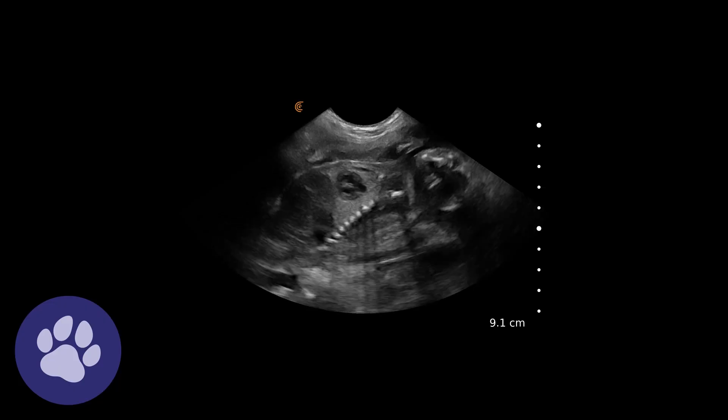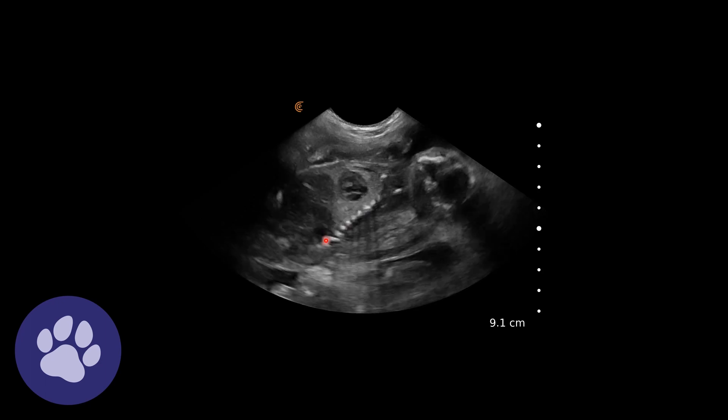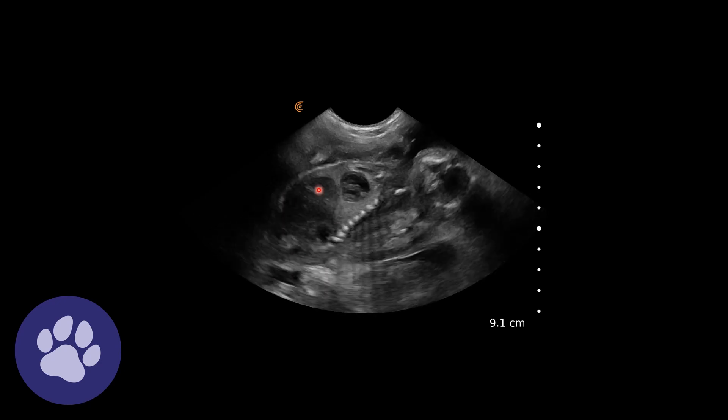We were able to confirm pregnancy on this scan. We can see the puppy's head up here, spine and ribs here. We can see the heart beating and we can see the abdominal organs here.